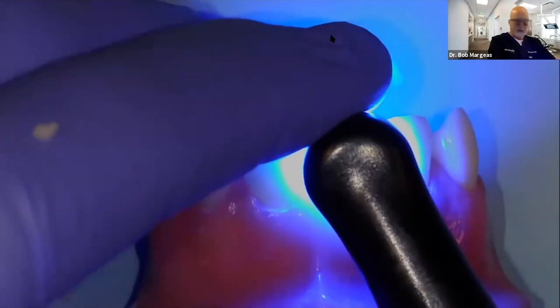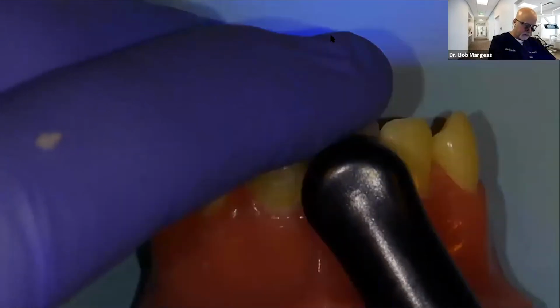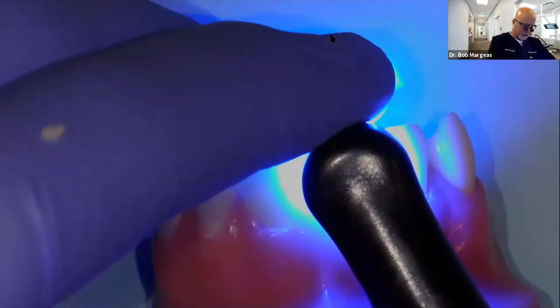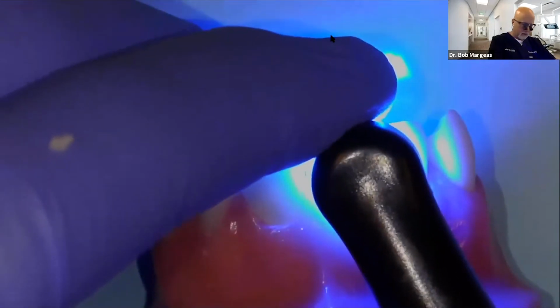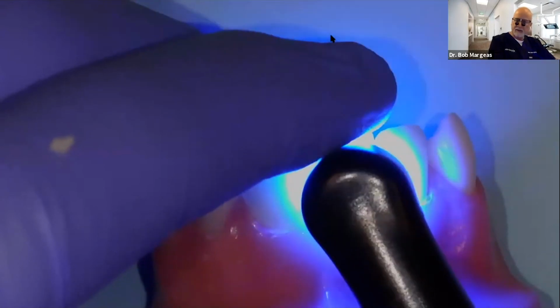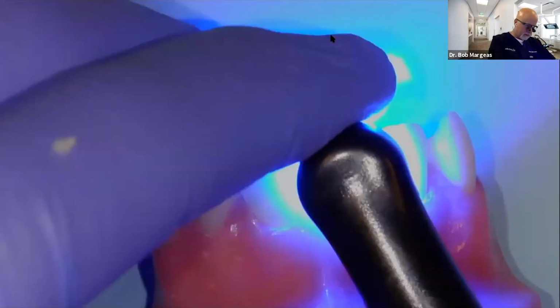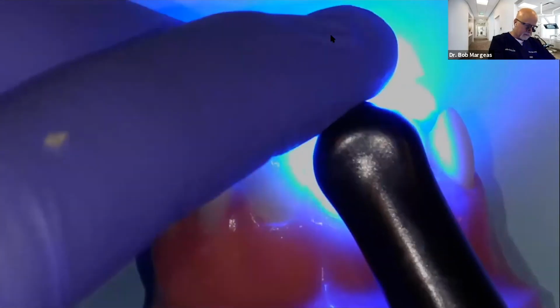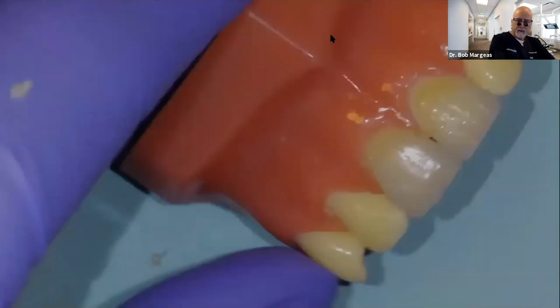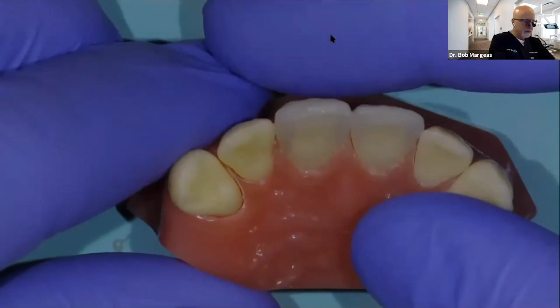I'll use discs to do finishing and polishing. Marcos Vargas and myself just did an article on the 10 steps, going to be in the Journal of Aesthetic and Restorative Dentistry, on where we're starting. You always want to start with the incisal edge to shorten the incisal edge, then the facial incisal line angle, the line angles, the dentinal lobes, the depressions. It goes through all of that. So now I'm ready to finish and polish. You can see it's sticking out a little bit, but that's okay.